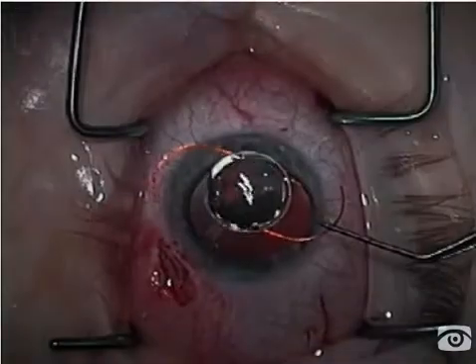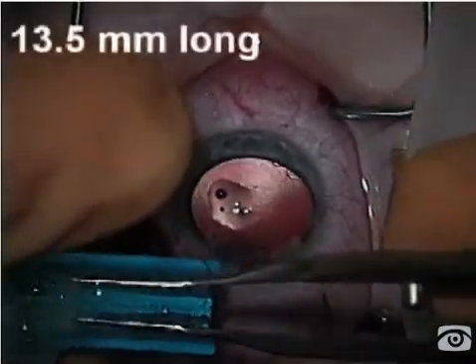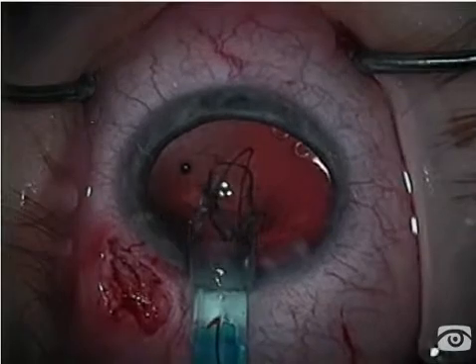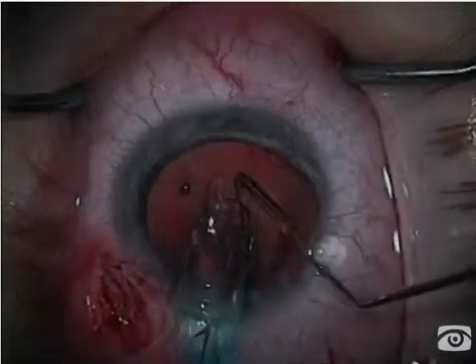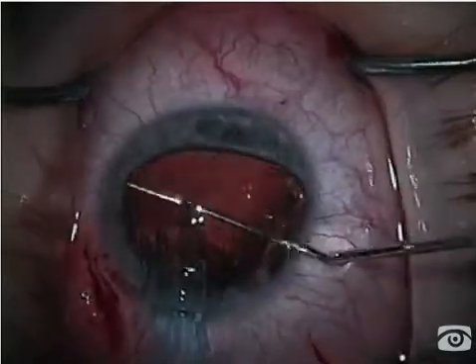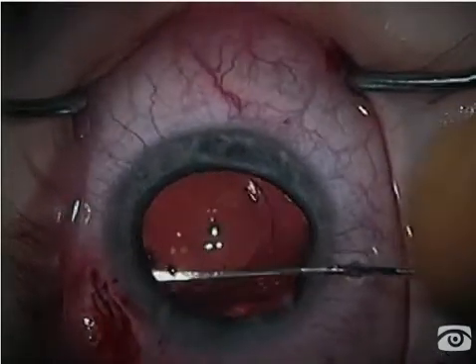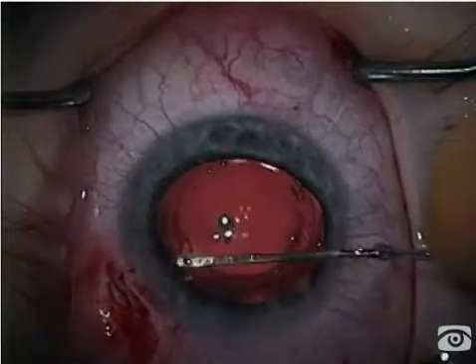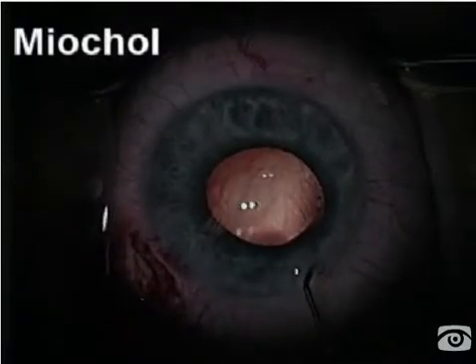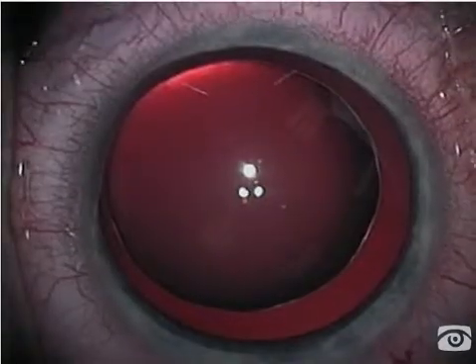Using 9-0 prolene, this will keep the lens-iris diaphragm from moving forward as it's apt to do. I'm going to place a longer-than-usual foldable lens — the Star AQ 2010, with a 13.5-millimeter overall length — into the sulcus. The first haptic wants to go the other way, so I deliver it slowly. The reason I'm placing this in the sulcus is that I don't think there's enough zonular support for the bag; it tends to slingshot forward and backward. I'm really relying on my haptics to position the lens, and the intact capsular bag will keep it from falling backward.